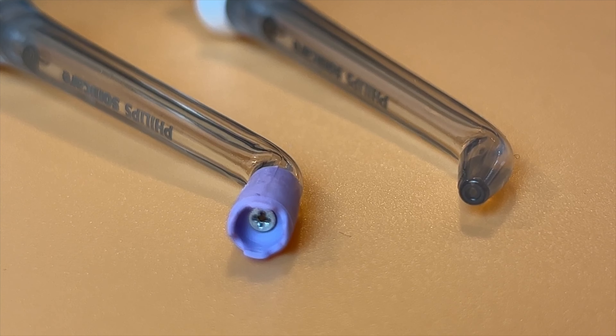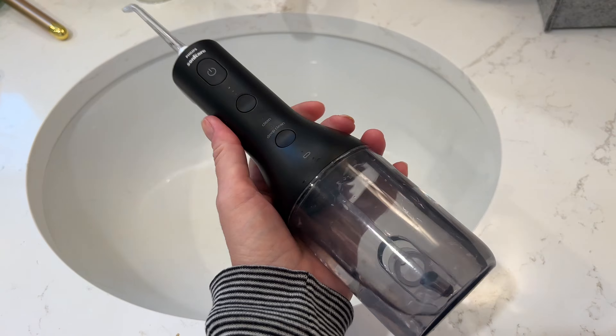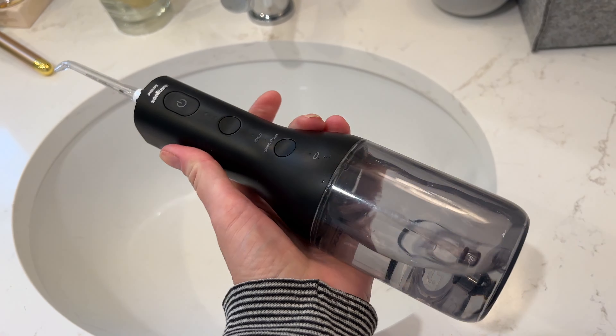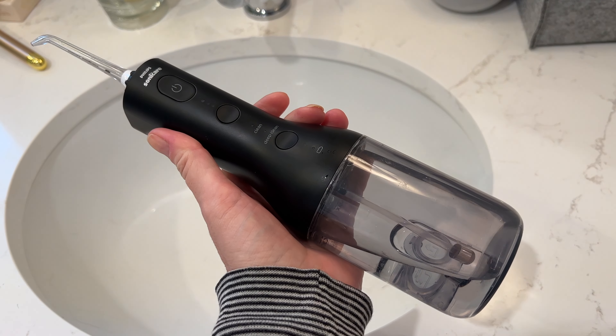Overall, I was kind of surprised that I liked this device and found it both useful and effective. The Philips Sonicare Cordless Power Flosser's cordless operation makes it really easy to use without having to worry about cords and tubing getting tangled. The weight and balance of the device also makes it easy to maneuver, and the variety of different tips lets you get the most comfortable experience. I like the options for different cleaning modes and intensities, and I found there is probably a setting that would suit everyone from kids to seniors.